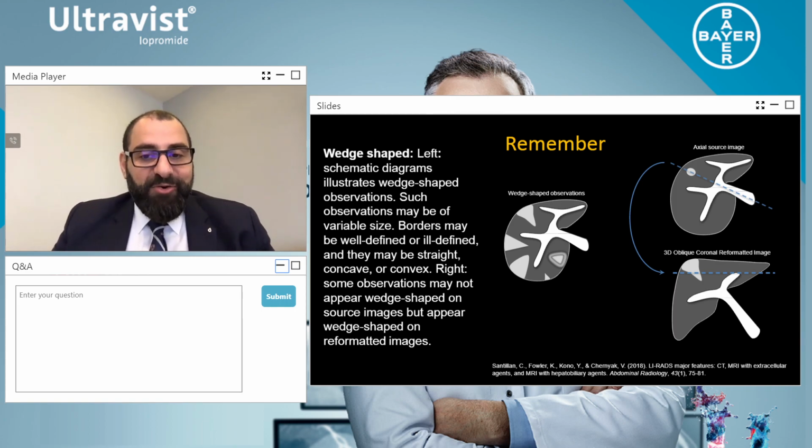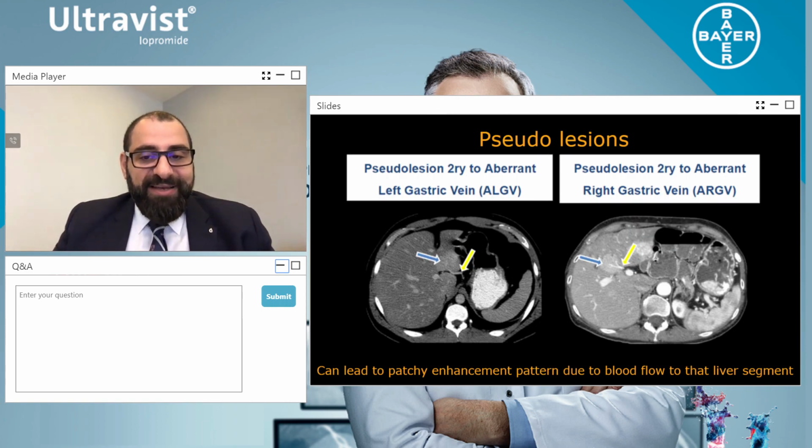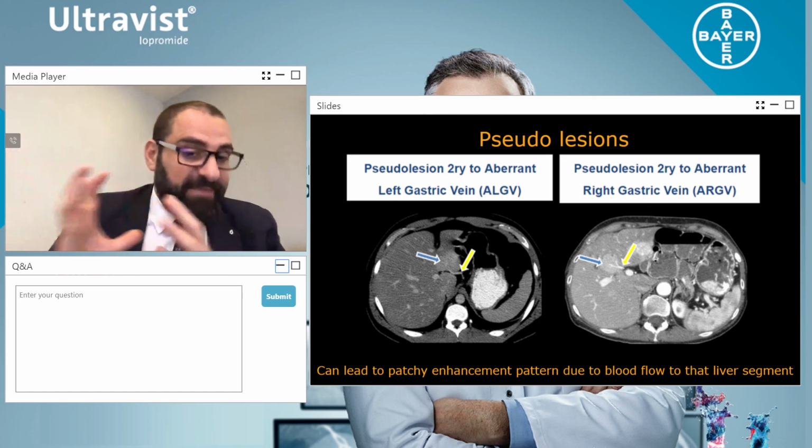Also, we can get what they call pseudo lesions, and this could be due to poor or reduced enhancement. This is where I want to come back and say, having a monomer gives you better flow because you can get into the smaller spaces because of the liver disease. If you have hepatitis, liver cirrhosis or a fatty liver, you have restricted flow into the liver and raised pressure within the liver. That's why it starts to expand and inflame. So you need contrast that moves like blood, and you need saline just to keep pushing it through as well.